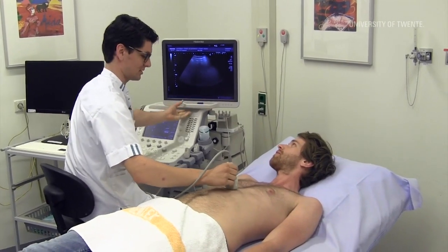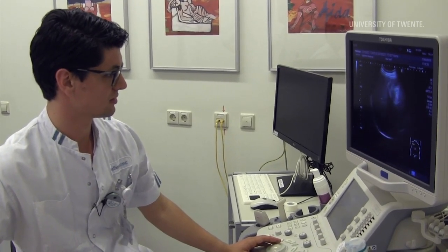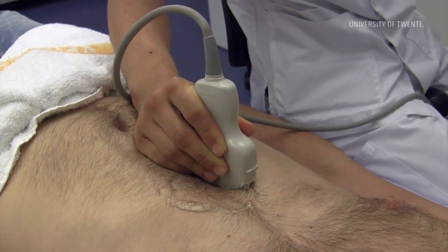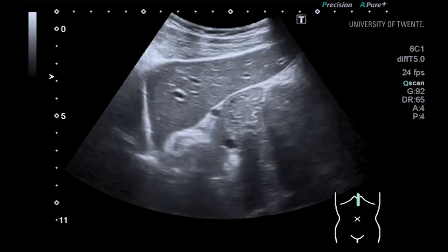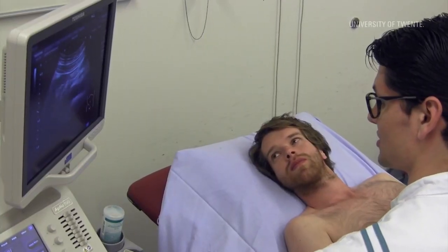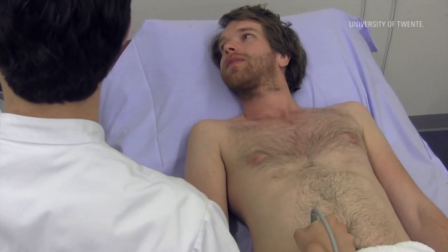The abdominal region contains multiple organs that can be examined using ultrasound. The liver, gallbladder, pancreas, kidneys, spleen and abdominal aorta are frequently assessed. It is also easy to quickly check up on the other organs when the organ of interest is, for example, the liver. Only the stomach, small and large intestines are difficult to assess, since they are air-containing organs.